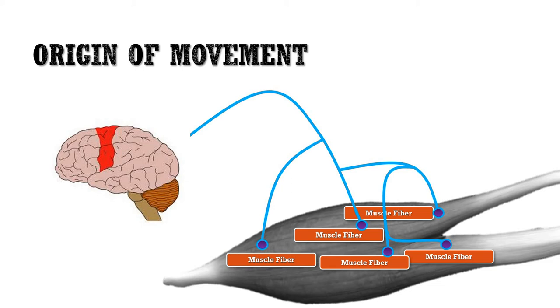We're measuring these action potentials that are travelling down the motor neuron to the muscle fibre, and the more muscle fibres that we need to recruit, the greater the amount of action potentials that are required. The more motor neurons are required, the more motor units obviously are required, and so we'll see a stronger signal on our EMG output.